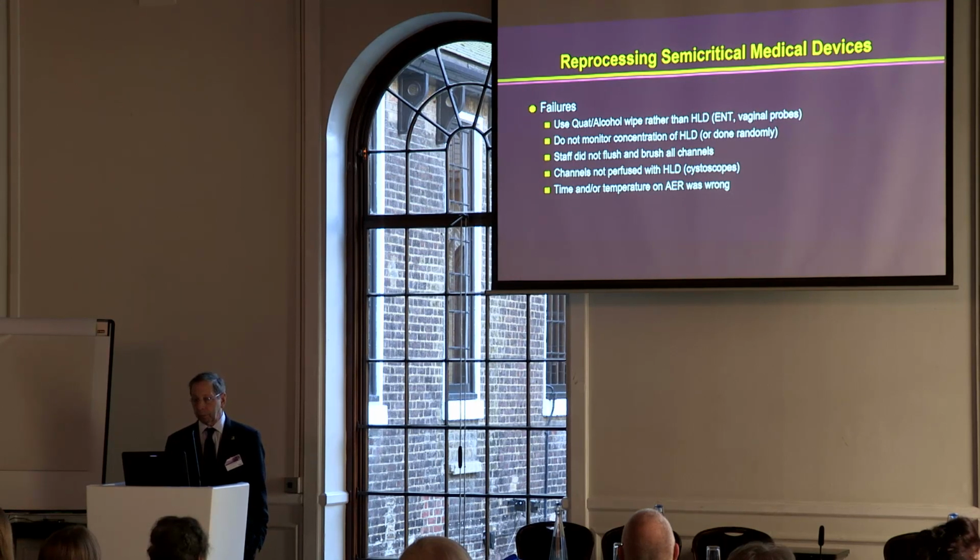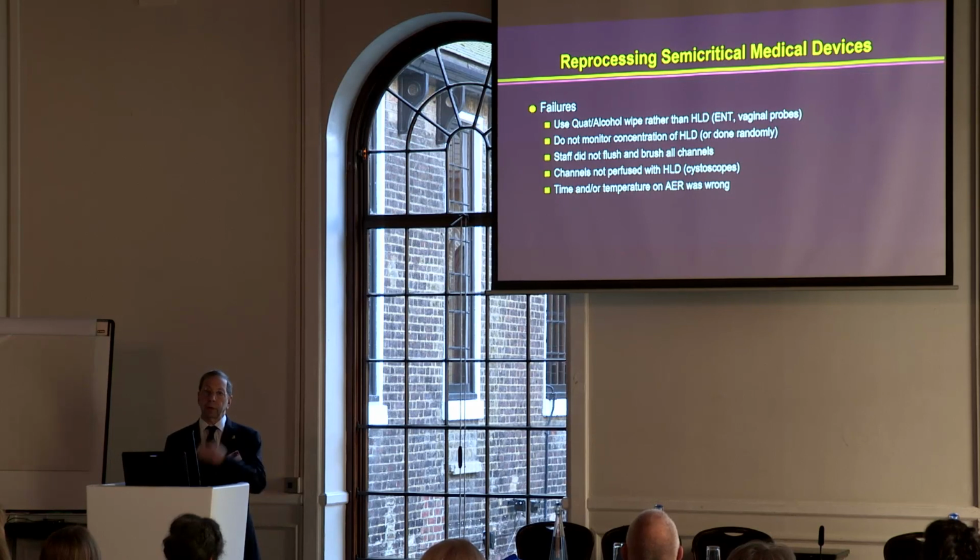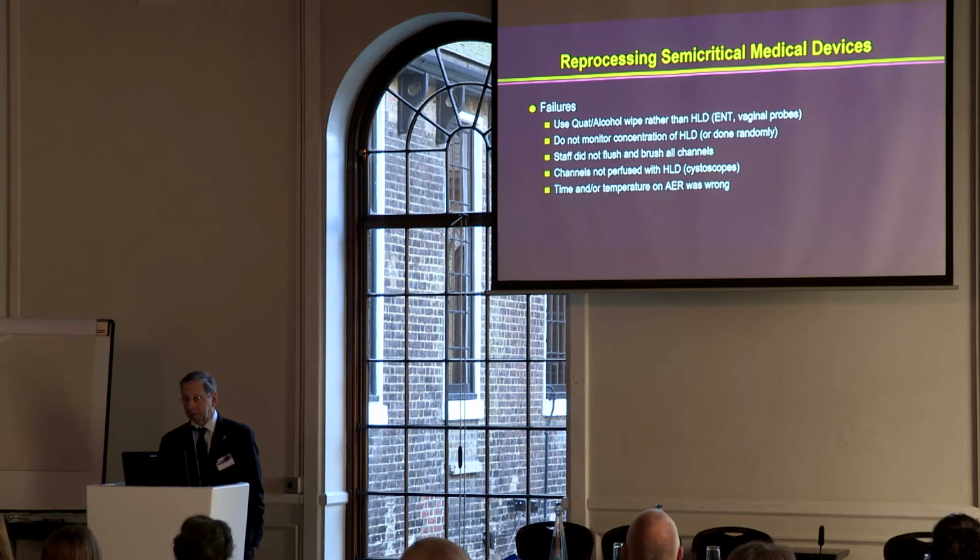Not monitoring the appropriate concentration of the high-level disinfectant at times, that is, allowing it to be diluted below its use concentration. Not flushing or brushing channels if it's a lumen scope. And certainly another issue has been not perfusing the channels, again, if you need contact with the chemical, with the bacteria. Inappropriate times and temperatures of automatic endoscope reprocessors are just some of the common errors that we see.